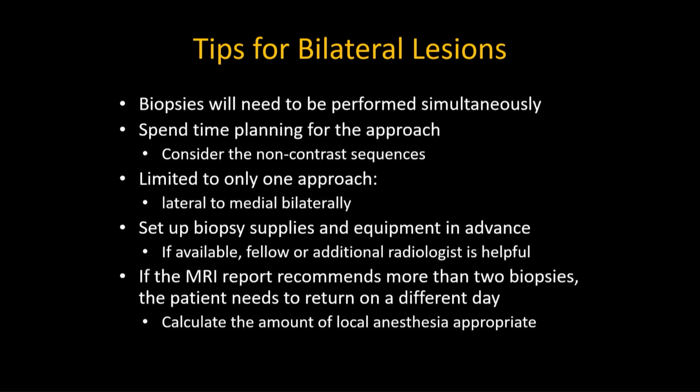So some other tips for bilateral lesions. Biopsies will be needed to be performed simultaneously if possible. Spend time planning your approach. Consider non-contrast sequences. You can only do one approach laterally to medially, so it's always helpful to set up your biopsy equipment ahead of time and make sure your lidocaine can be drawn, et cetera, so that you are ready to go for that second biopsy.